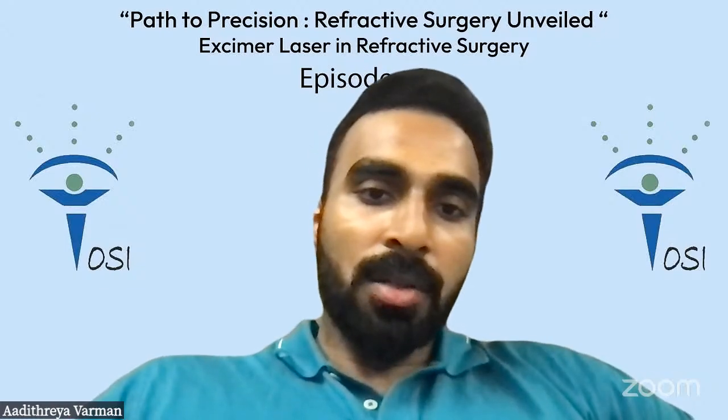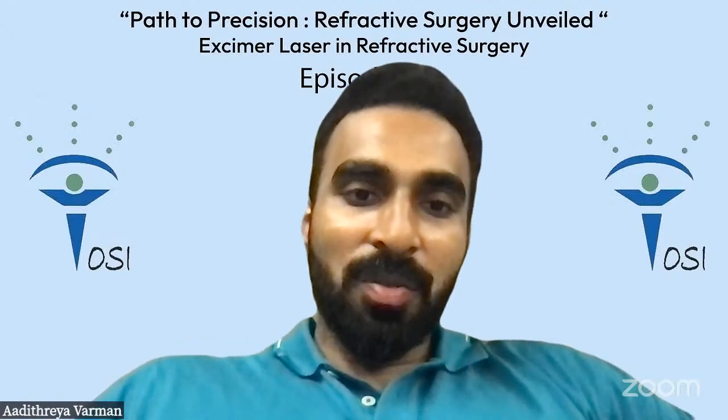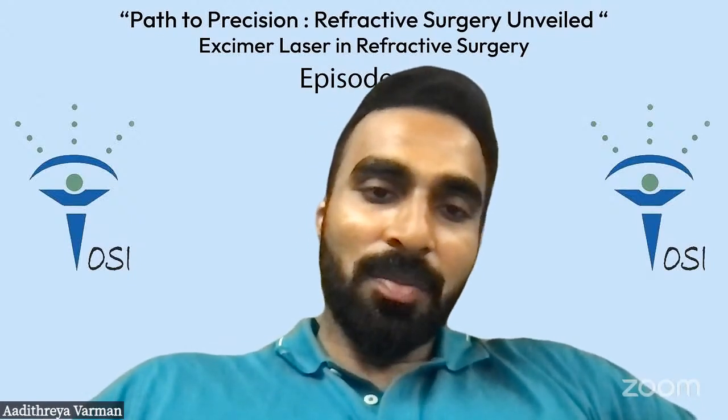And then they have to be enhanced for half a diopter. For example, the 5 patients I had to enhance were all for half a diopter of cylinder or half a diopter of sphere. So you have to be that accurate in your refraction. So I think as a procedure, it's a little tricky to implement.